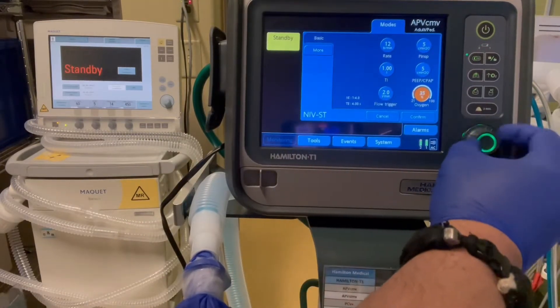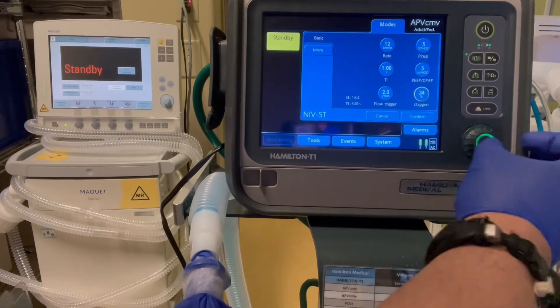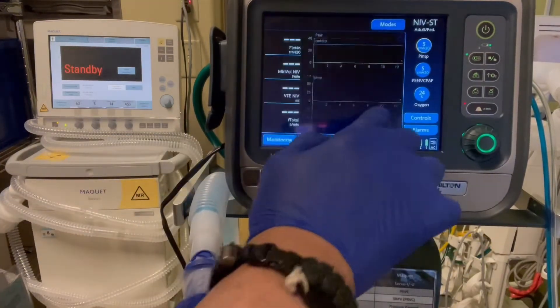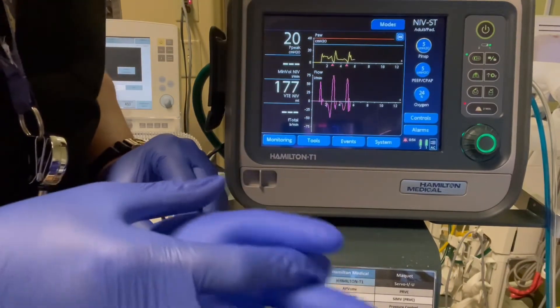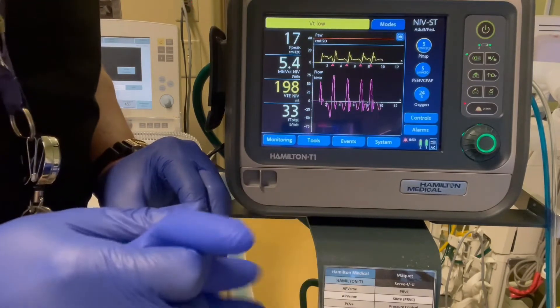We're just not going to use a lot of oxygen for this patient. I'm going to go ahead and confirm and start ventilation. And we have our patient on the BiPAP. Very important to know though, this is not a made-for-BiPAP device — it's a ventilator. So it's going to deliver breaths like a ventilator, and there are a couple of tweaks we have to do to make it more comfortable.